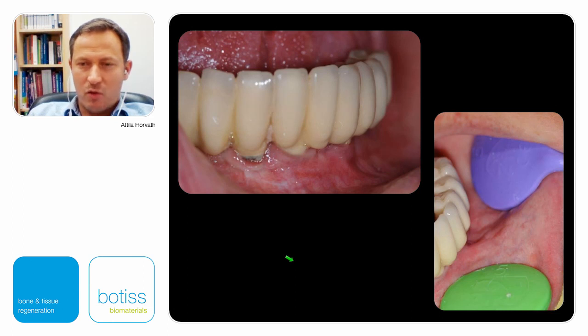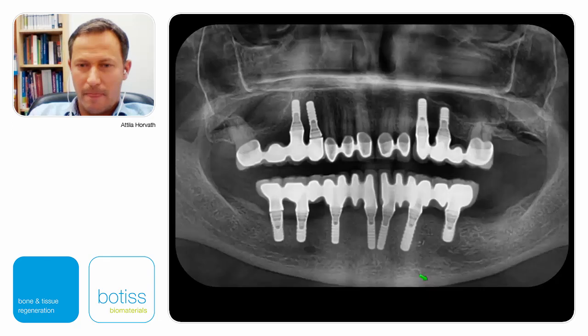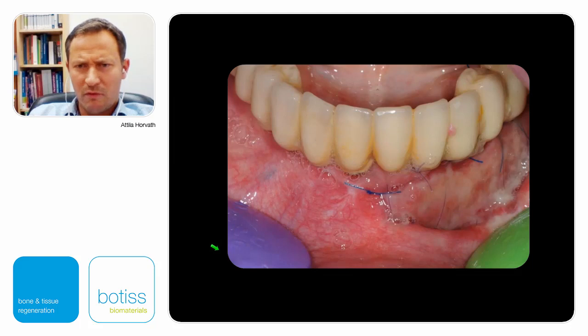So it looks like if we try to pull the whole buccal side on the lower left side, we can see that there is no vestibule here. And as I said, it's nice, good quality implants, all Straumann implants, soft tissue level implants, and no deep bone resorption has started. The vertical dimension of the bone is still there, but even with a good quality implant, even with, let's say, acceptable bone levels, without keratinized tissue, without soft tissue, we can't be successful.